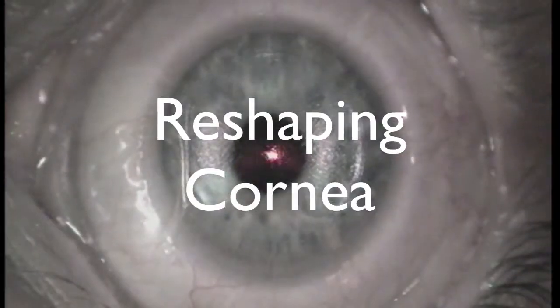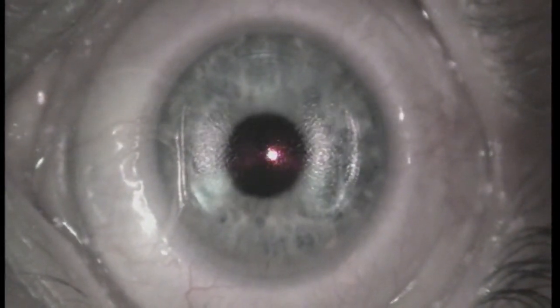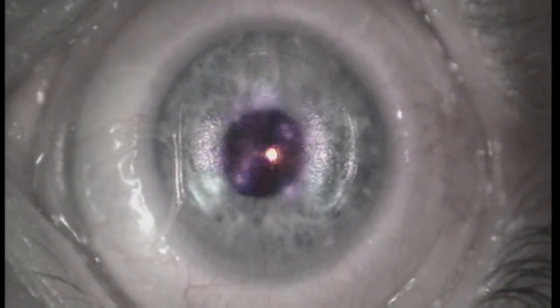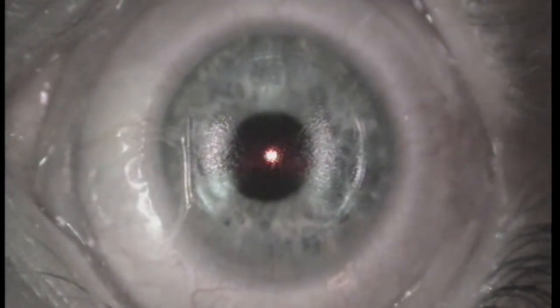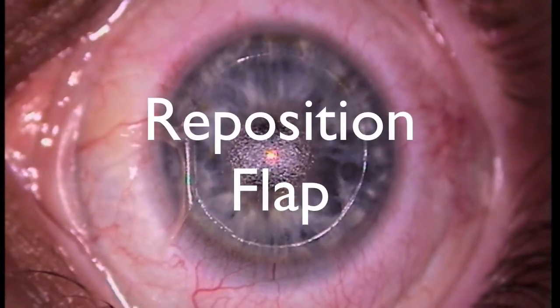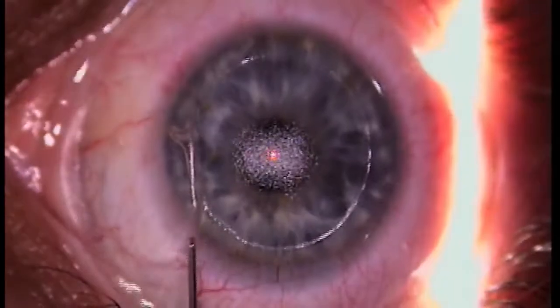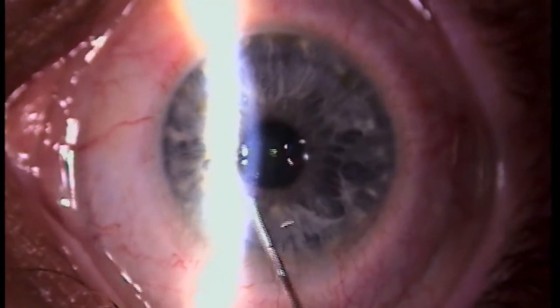Turn the lights down a little bit here. You're doing great — right at the greenish flashing light, you're doing great. And a couple of drops here. There's a green light. All done.